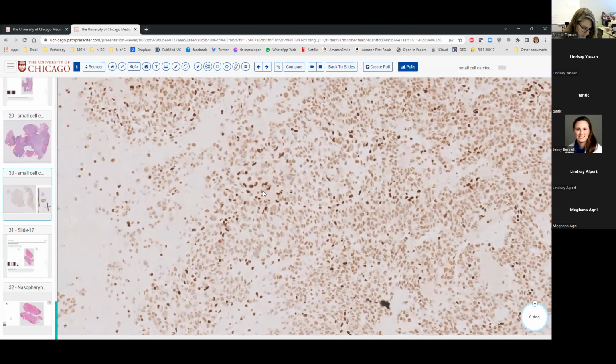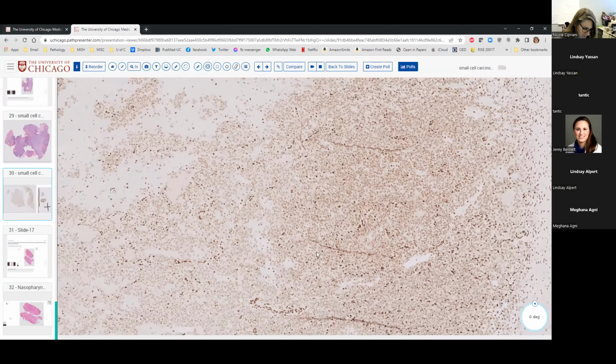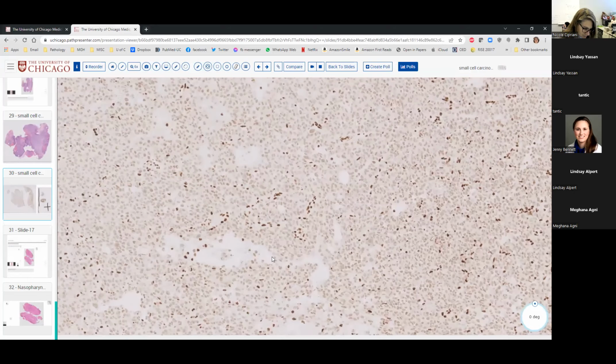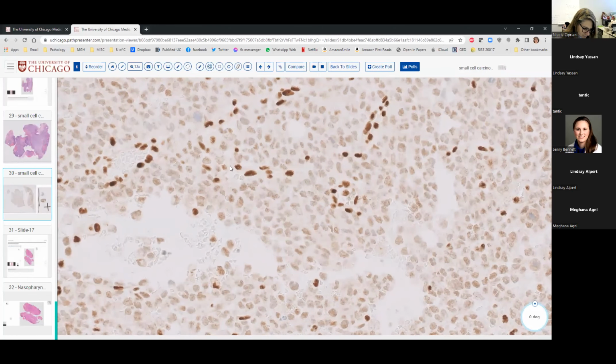Here the darkly staining cells are lymphocytes, maybe even a few vessels, but the tumor cells' staining is markedly decreased compared to your internal controls. Some areas showed better loss of expression, but either loss or decreased expression compared to the controls is diagnostic.